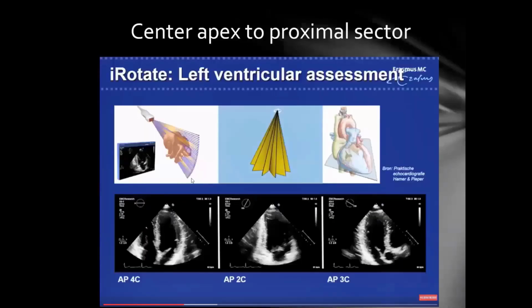So this is what I'm talking about. When you set up your 4-chamber view, it's always going to be a little bit rounded because the true apex is actually seen in the bicommissural 2-chamber view. So you want to discount between the two, but your goal is to line these up so that as you rotate electronically, or if you have a perfect hand, rotate the probe manually because you don't have the electronic steering, which is pretty rare these days, you should be able to get a good 4-chamber view. You notice how centered the LV is? So slide your probe until this is centered at the expense of the RV.